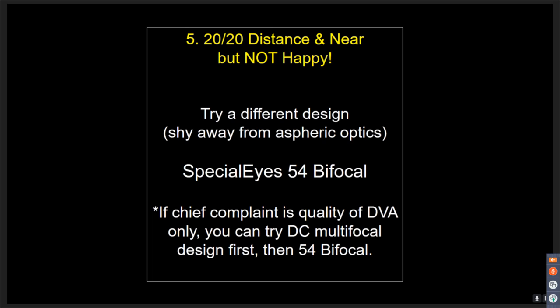And the smaller the pupil gets, when you get up into patients that are in their 60s, and the pupils are getting pretty small, sometimes there's just not enough room to use an aspheric type design or a three-zone design. So the bifocal really is my choice on many of these. And also, even on young patients that are, let's say, 45, 46, that still have a good accommodative ability, you can put a bifocal on them, just don't overplus it, and they'll use their own accommodative system to be able to focus at different areas. So you want to make sure you give them enough so they can see their computer screen, and then make sure they've got enough accommodative flexibility to bring it in to the 16 or 18 inch area. And so you've got a lot of versatility with these lenses.